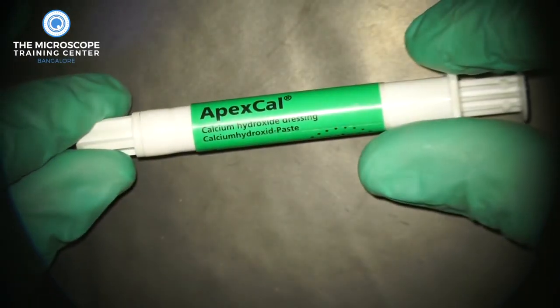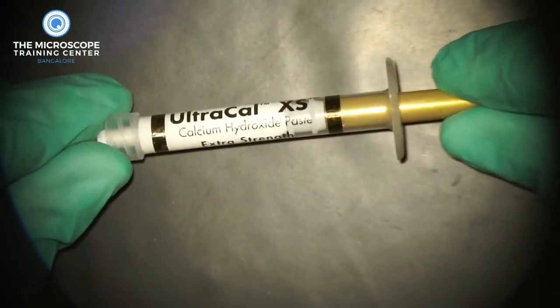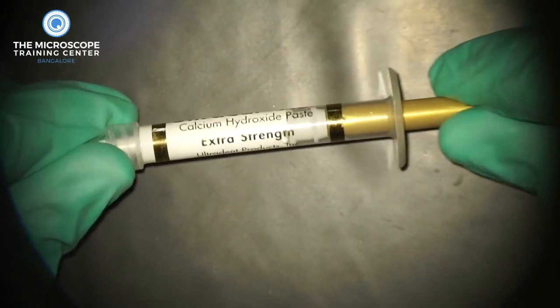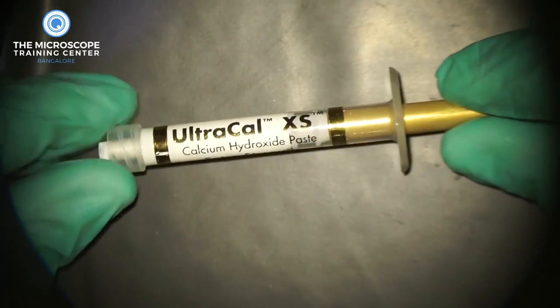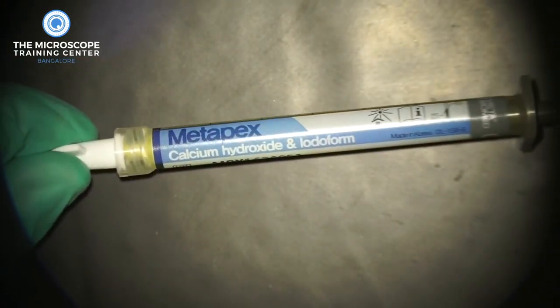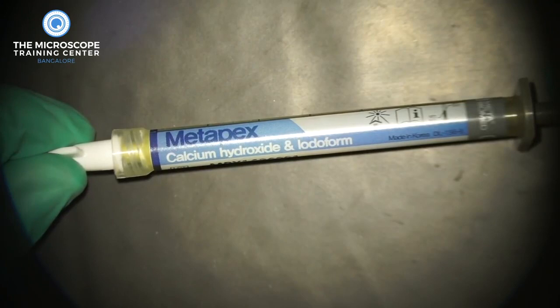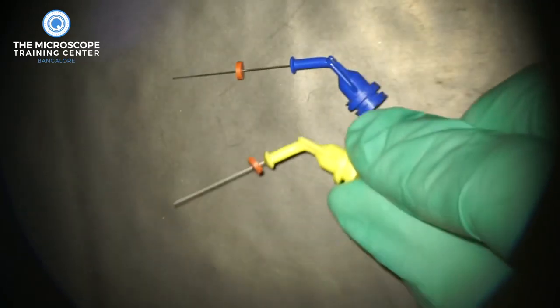We mostly use Apex Cal from Ivoclar Vivadent and Alter Cal from Ultradent, both of which are aqueous solutions of calcium hydroxide. Occasionally for open apex cases we use something called Metapex, which is calcium hydroxide mixed with iodoform. This is much thicker than the other forms of calcium hydroxide, so you don't want to use it in regular cases or in narrow canals because it just doesn't go through.